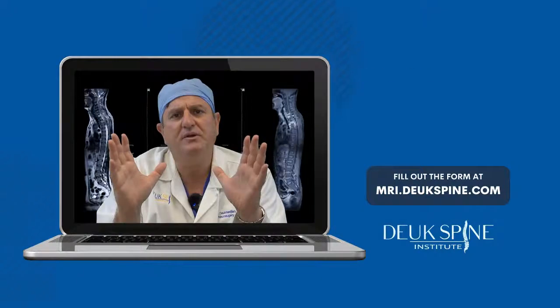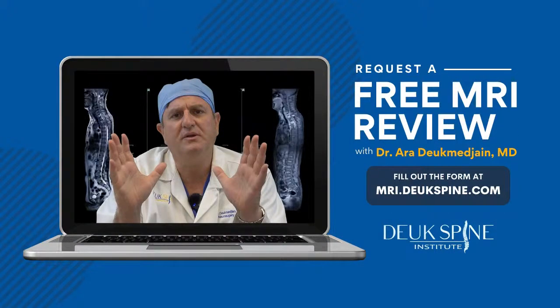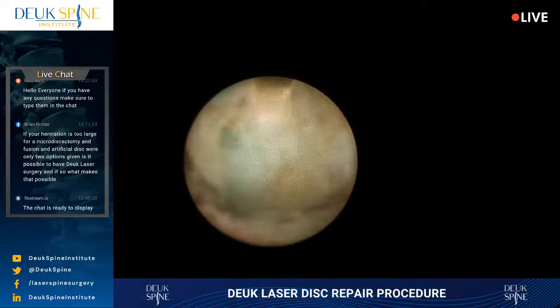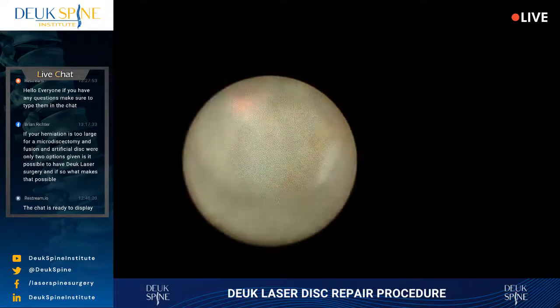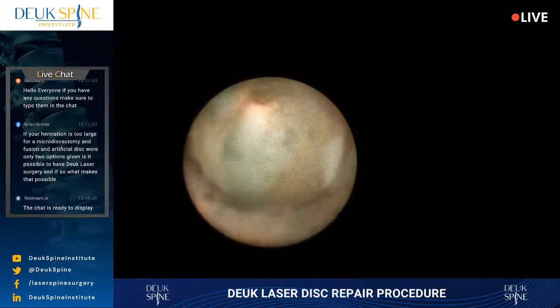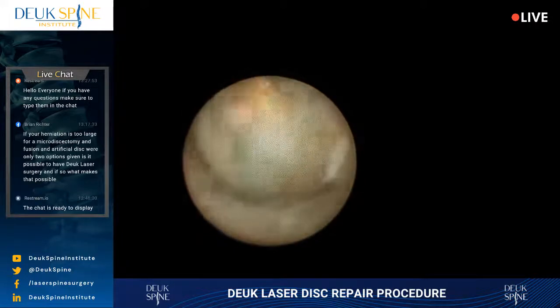This is all part of the herniation. It's all scarred here in the back of the disc, and I'm just debulking it. We call it debulking in surgery. I'm removing the mass of the herniation, one layer at a time, using the laser. The laser, by the way, for those of you wondering how precise it is, well, look at that herniation right there. That thing is huge in the foramen.